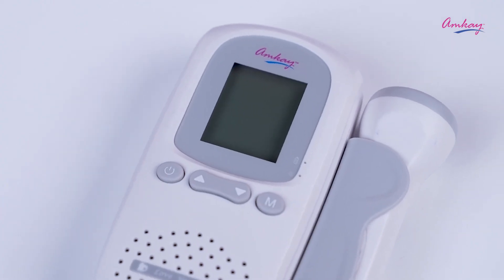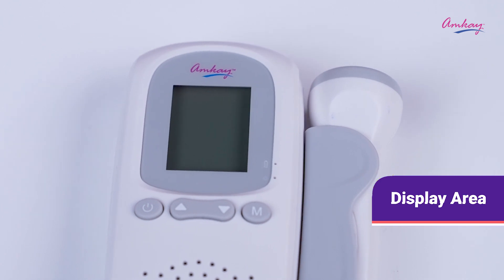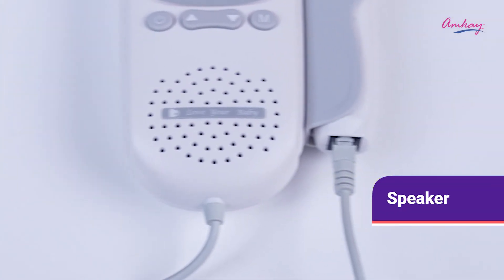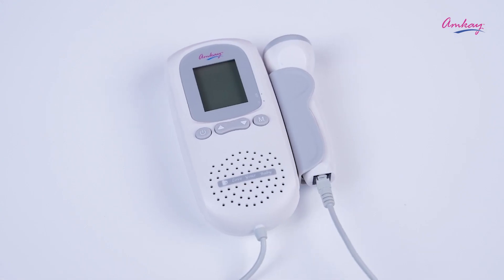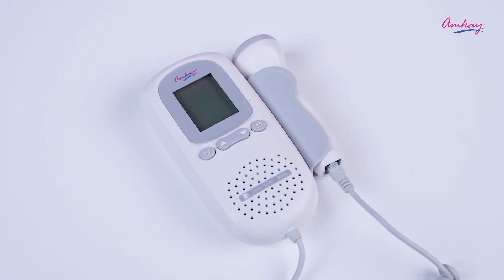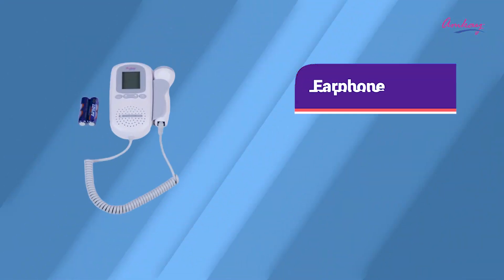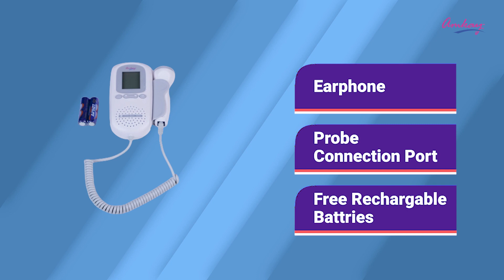The main unit of this product comes with a display area to keep all the readings in check, a speaker to let you hear the heartbeats, a probe to make the process work, a DC port to connect the USB, an earphone, a probe connection port, and free rechargeable batteries.